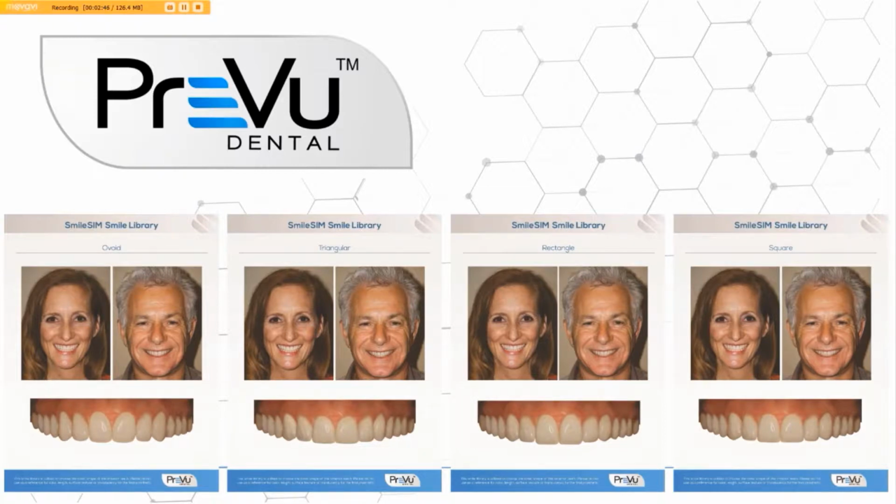It just gets us off on the same page so that we're communicating right from the beginning. These smiles can be shared with the patient, and often these cases begin even before the records are collected. A smile simulation is completed to show the patient the proposed smile, and that is what we build our case around. In fact, the teeth in these smiles are based on STL files, which are close to a 1-to-1. So in other words, the smile simulation that we provide will share the exact tooth mold and shape of the surgical prosthetic, and then eventually the temporary and the final prosthetic, which is a unique service.